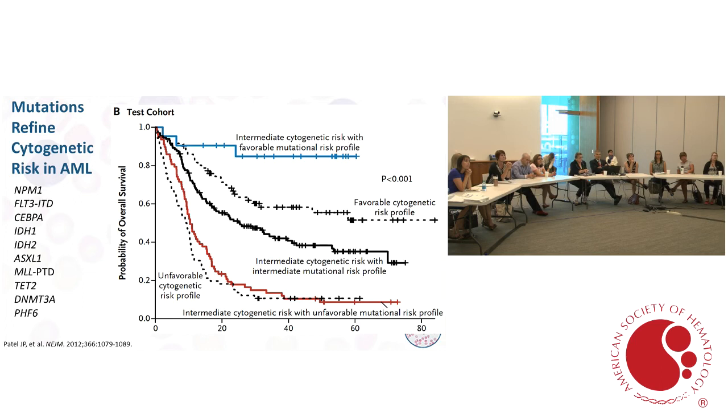So if you see something like this and you're not exactly sure how to interpret it, did this patient have a chromosome 5 and 7 abnormality? You call your cytogenetics lab and ask them to describe it to you. In many cases, if you read their interpretation, they will note that the rearrangement deleted 5q. So in your mind, you've put that patient in a particular classifier.